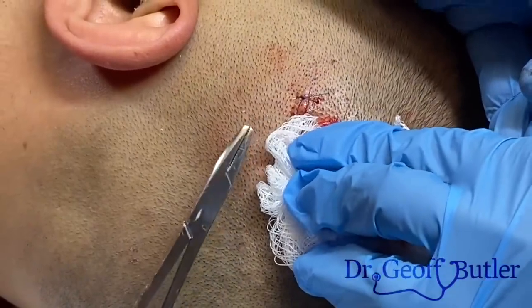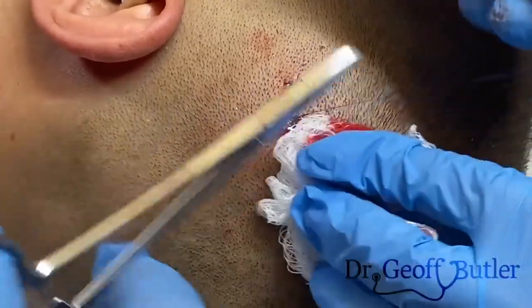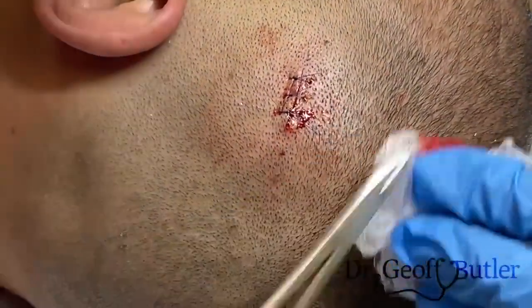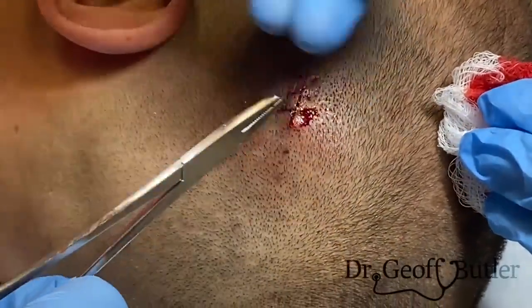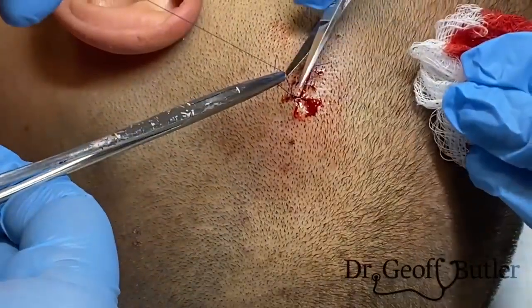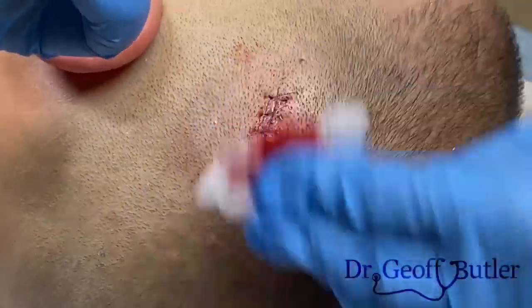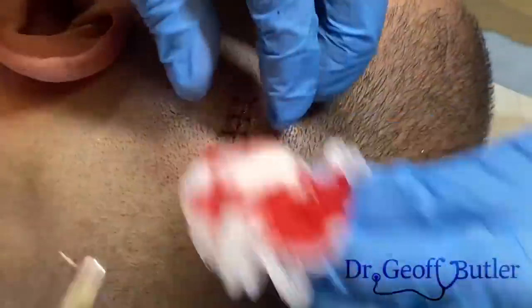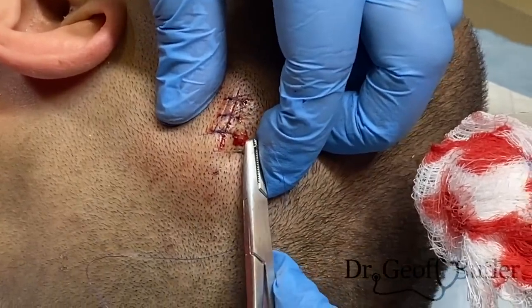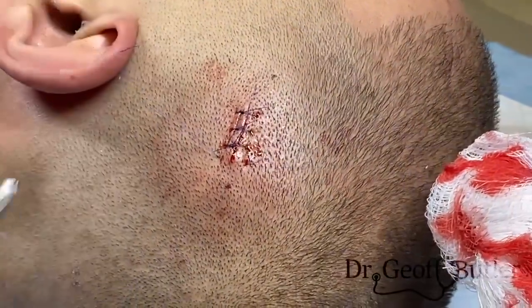Now sometimes if you have really active bleeds, see what's happening here, these needle drivers, this set here, it's becoming a bit dull. So this set's on its way out. That's slipping a little bit, sorry. See how that doesn't grab there? The teeth are becoming a bit worn. This one's not bad at all, but if it was really actively bleeding and we were worried about how much pressure was there, we'd put a pressure dressing on this, almost like a turban that he would wear just for the first couple hours, just to make sure that settled back down for him.